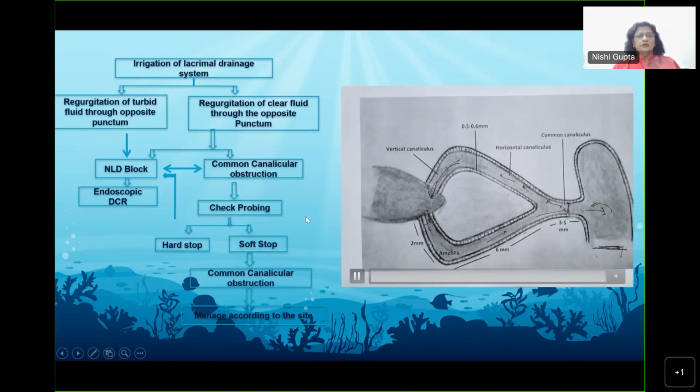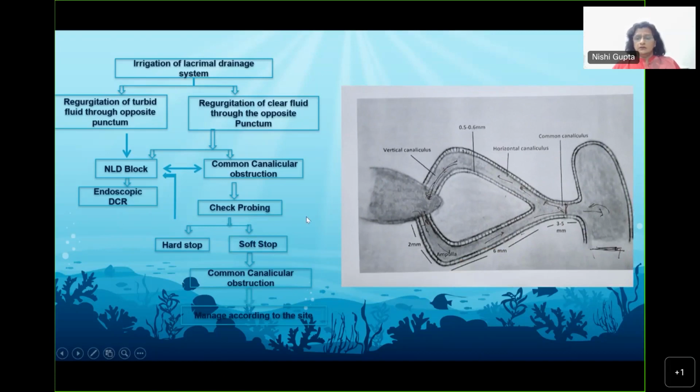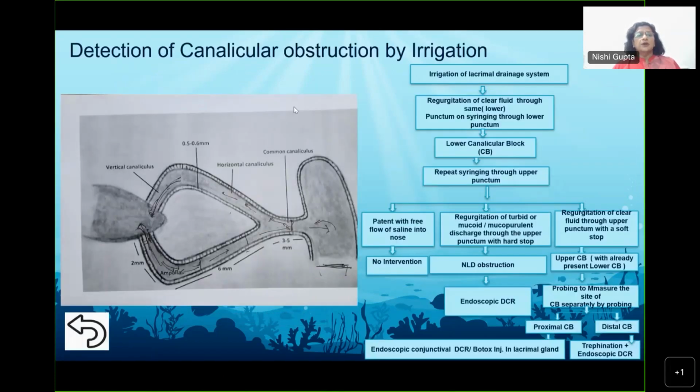Coming to the next slide, it is important to detect canalicular obstruction. So far we saw very clear factors which would tell us the site of block. But if we have canalicular obstruction, then let's look at this video.